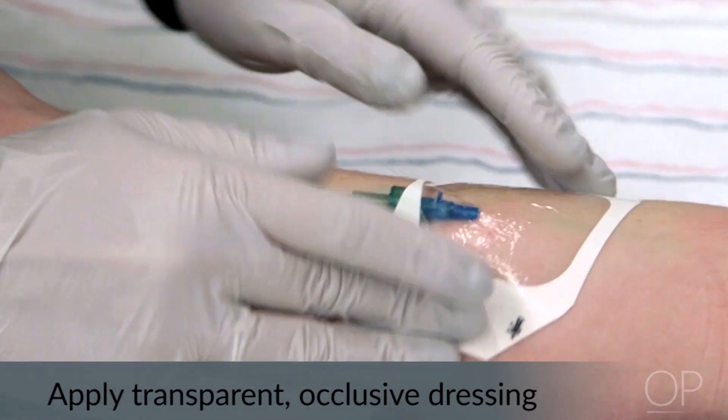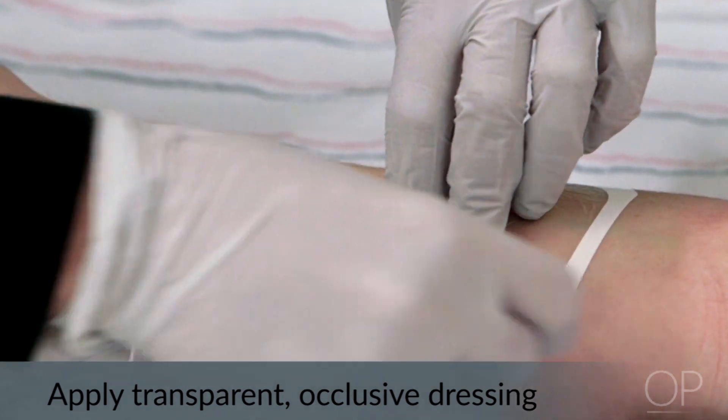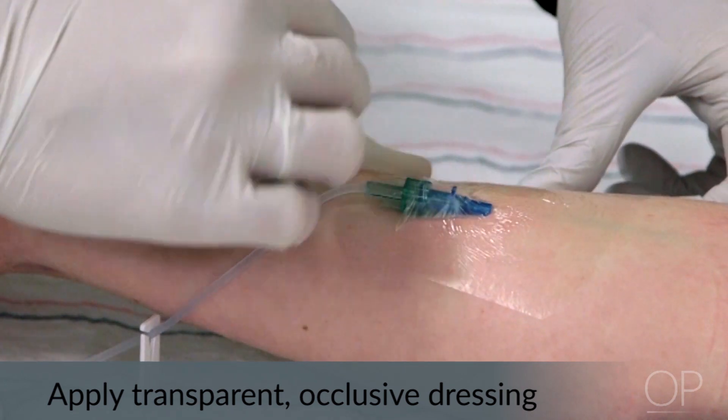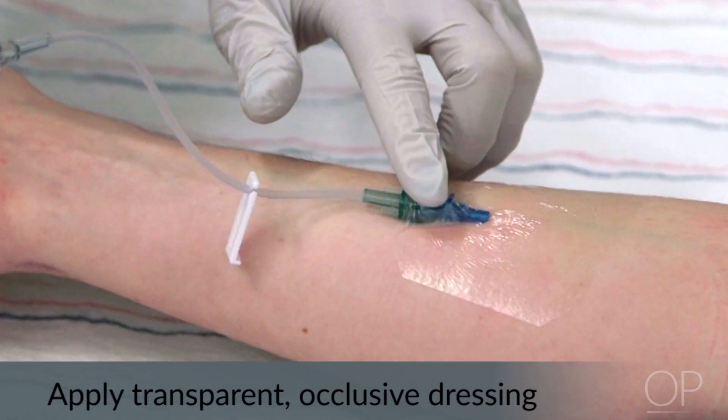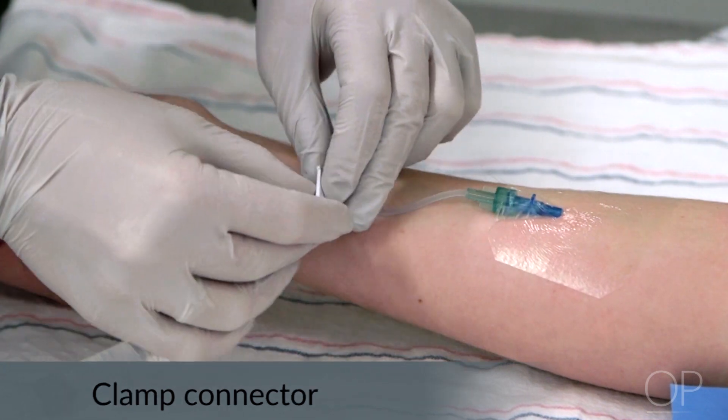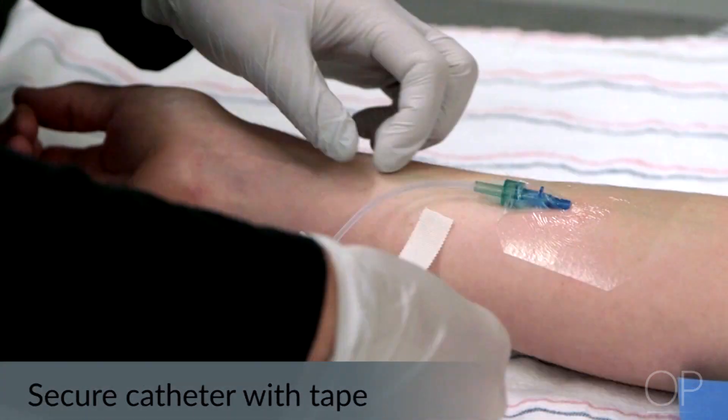Make effort not to cover the insertion site with anything opaque. This is important so that the site can be monitored for signs and symptoms of infiltration or phlebitis. Assess again for patency by flushing and clamp the connector.